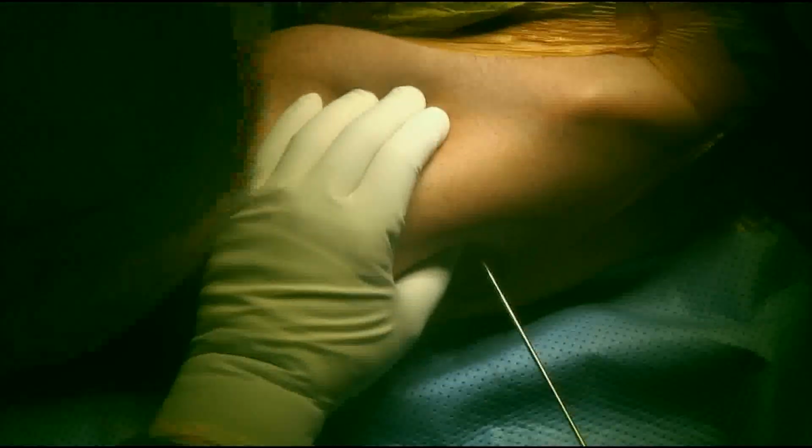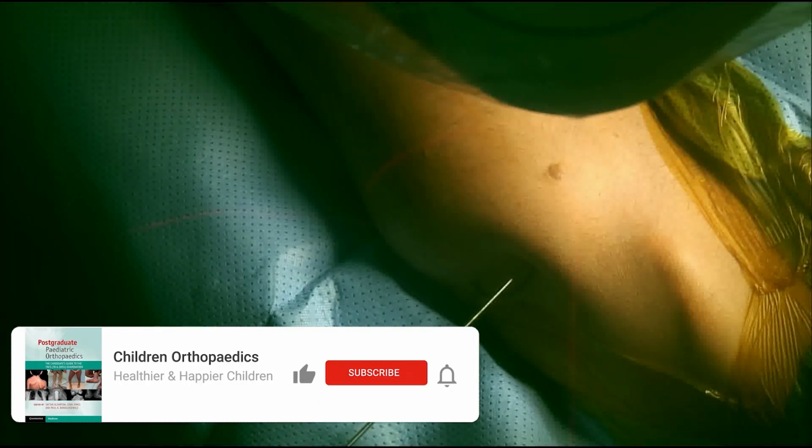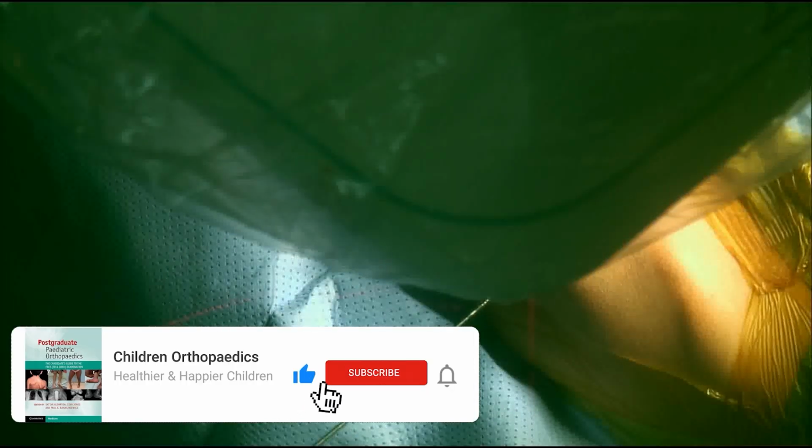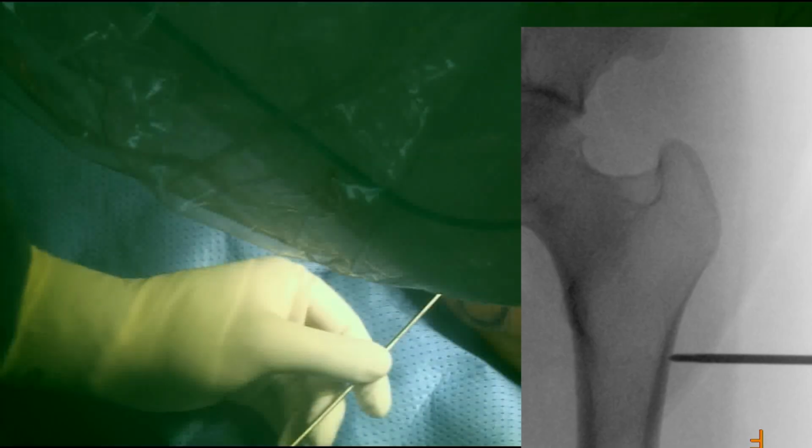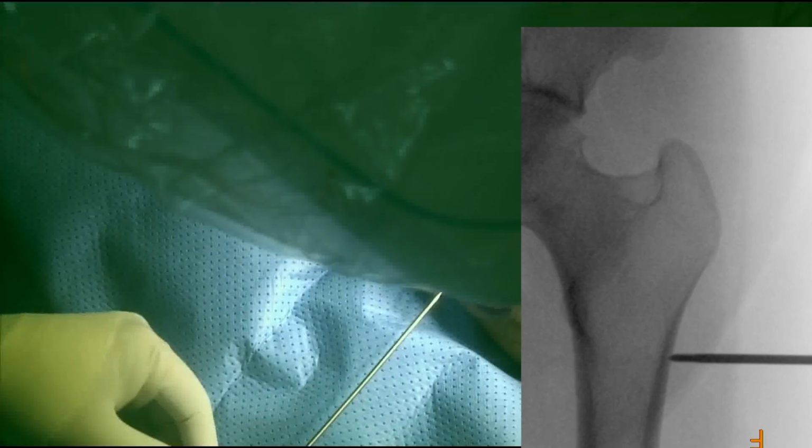After preparation and setting up the system have finished, we start our procedure. The first part of the procedure is to identify the involved bone to the system. Here I usually use a 2.5mm threaded tip wire. I insert it into the bone that carries that particular osteoid osteoma, and I use this to connect it to the patient tracker that would be identified to the system.